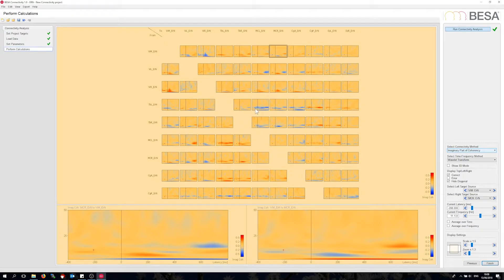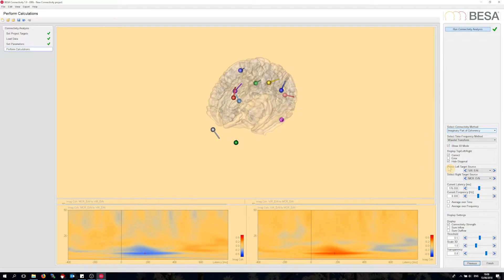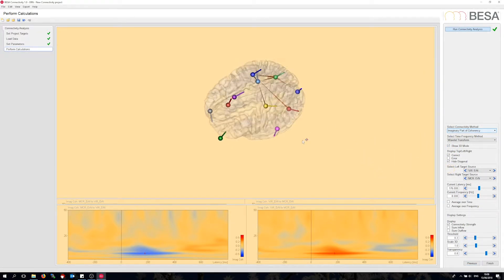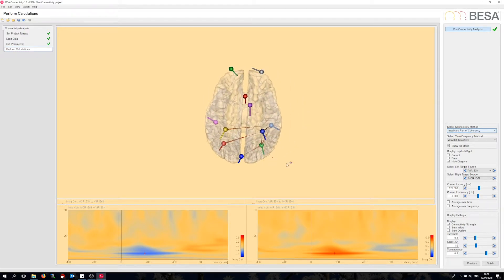The VIR and MCR sources show some coupling here. Let me look at this in 3D mode. Now I can see a really interesting network spanning the visual areas, the right motor cortex used for pressing the left button, and the right temporal lobe.